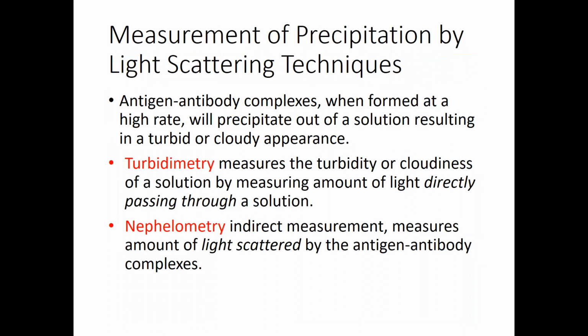The point of measuring precipitation reactions is we're going to be looking to see what level of antibody-antigen binding is happening in a patient sample. We can do this, as I said, by a number of different techniques. The first two are measurement of precipitation reactions by light scattering.